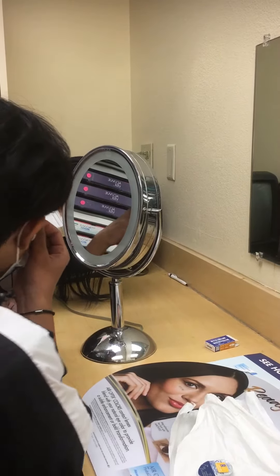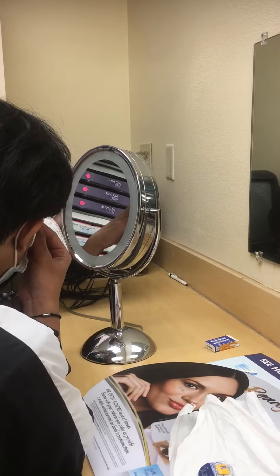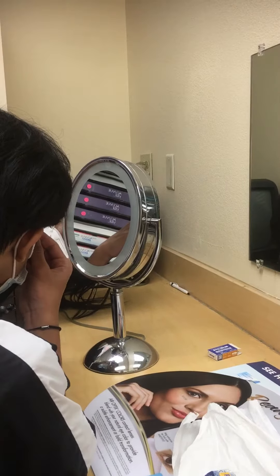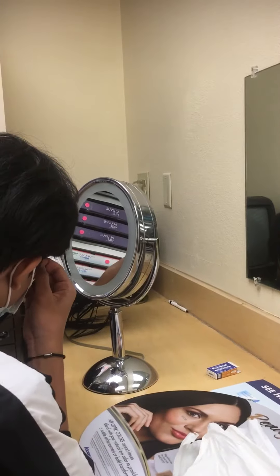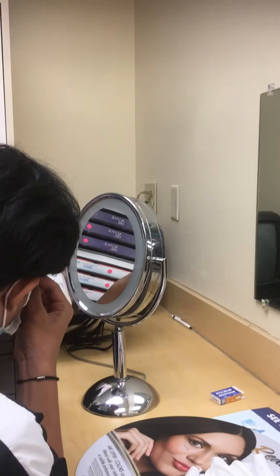He should do good, because he let me put him in. He's not afraid. And then I already see it down, so. Oh my God, I'm going to die. Oh, where's it at? It's down. Just pull it out. You just pull it. Go back in your eye, because it's all the way down.